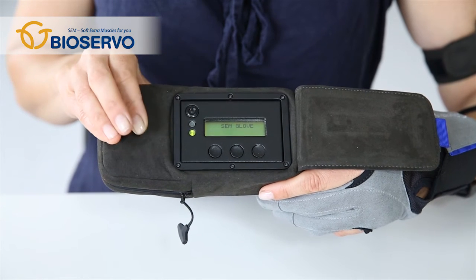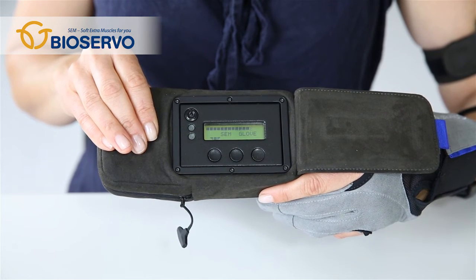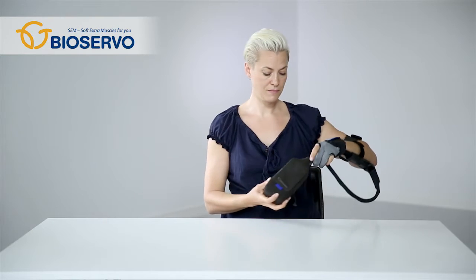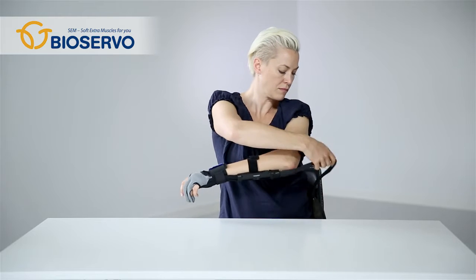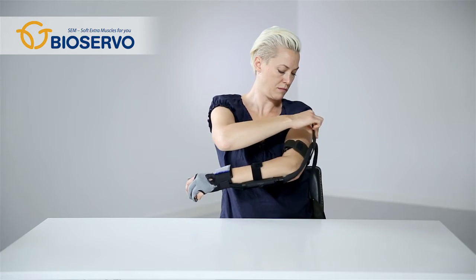To start your SEM glove, press and hold the on/off button until you hear a short beep and see a green light. Put the SEM unit onto your hip, insert the SEM cord into the arm strap, and your SEM glove is ready to use.